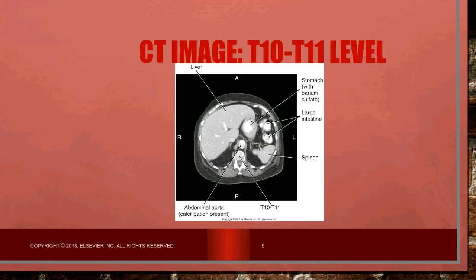Now, in this chapter, notice they also reference some CT images. This one is on page 108. The only thing they want you to start being able to appreciate is that when we look at CT, they are sectional images, meaning the body is sliced, almost like a loaf of bread, and you pull out each slice. So you want to start familiarizing yourself with how the organs look in sectional images.